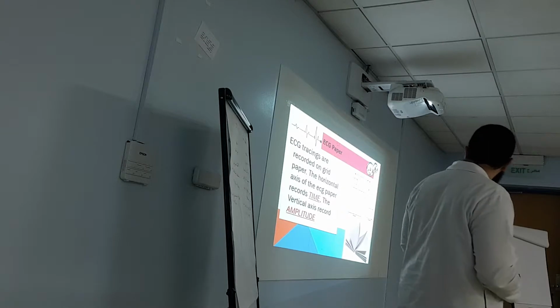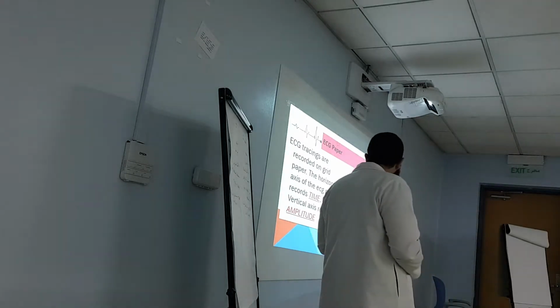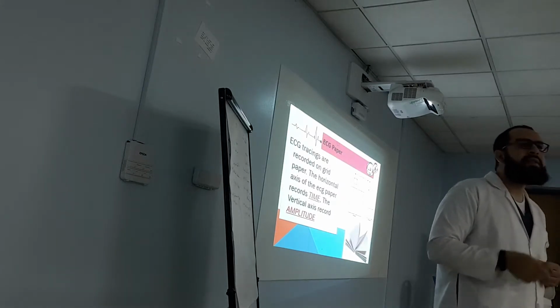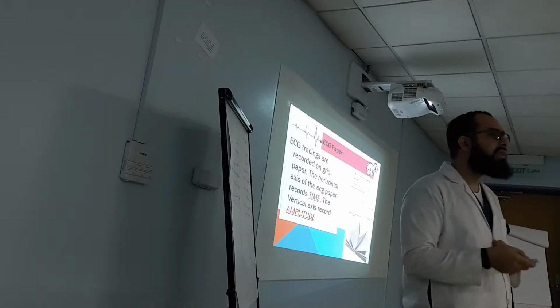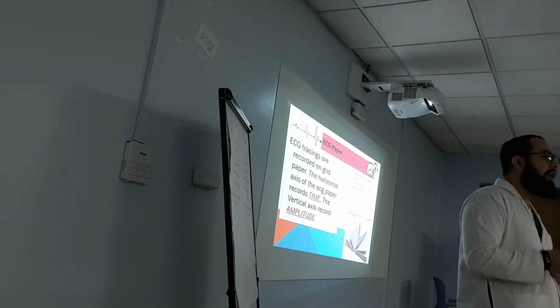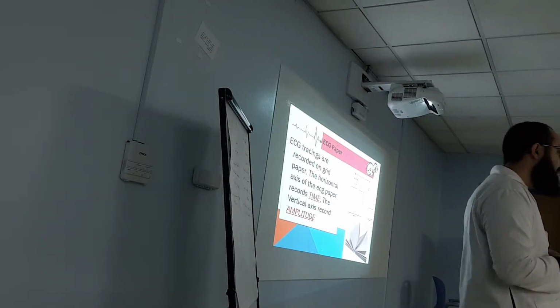So the width or the length in the paper represents how much time the heart takes to produce the beat.